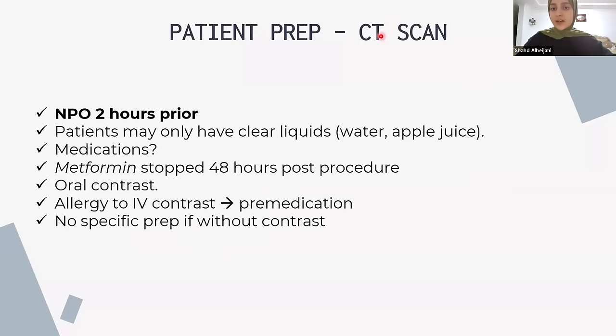So for a CT scan, now I wanted to focus with the headings because different cases will have different requirements for the patient. So here for a CT scan, patient will be NPO 2 hours prior to the CT scan. Patient may only have clear liquids. And for the medication, does the patient have to discontinue the medication? No. Only thing that they have to discontinue is the metformin.